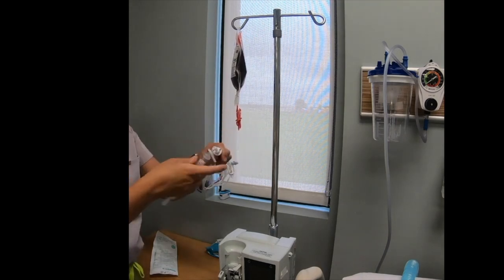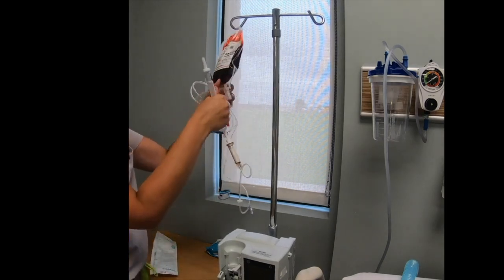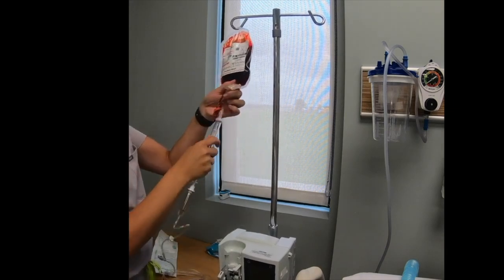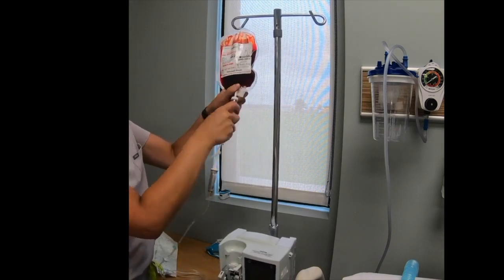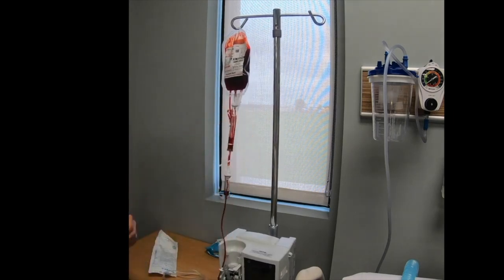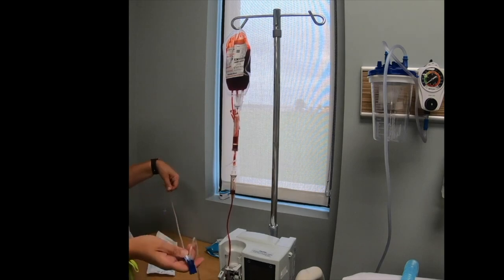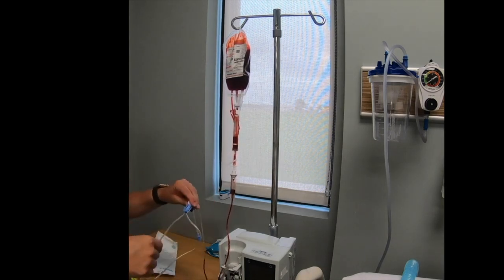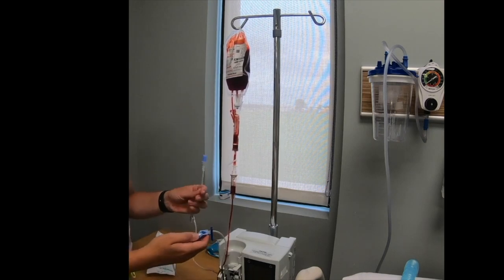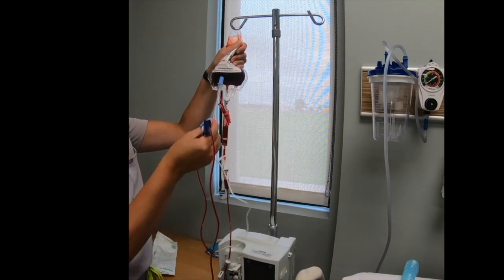You may then remove the spike from your filter and utilize it to access one of the ports on your blood bag. Then squeeze the filter chamber and then the drip chamber of your primary IV bag and proceed as usual. Prime the entire set with the blood all the way to the end prior to connecting to your patient. With this type of transfusion setup, it is important to have a small bag of normal saline available for when the transfusion has ended, so we can continue to flush the line through with saline so the patient receives every bit of the blood transfusion.